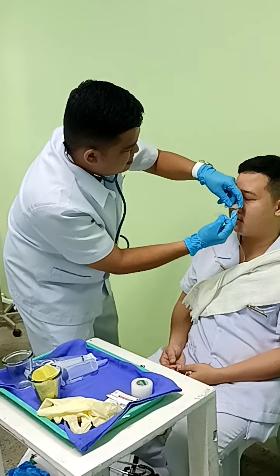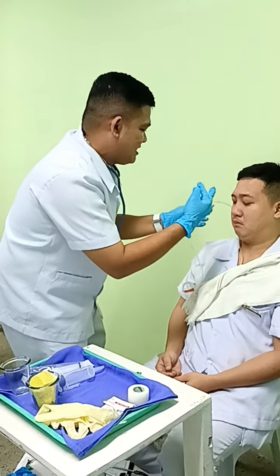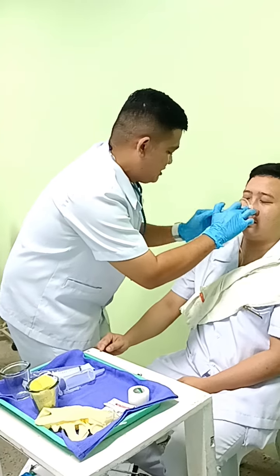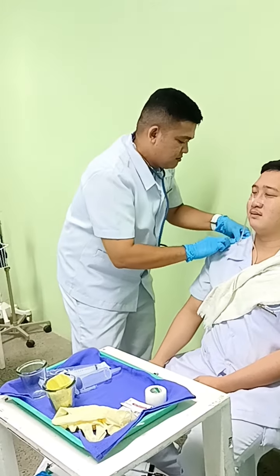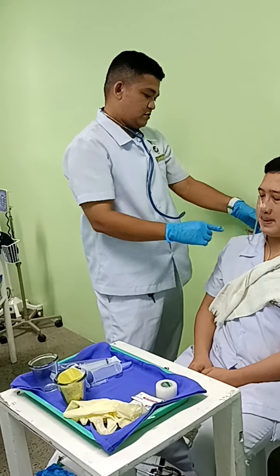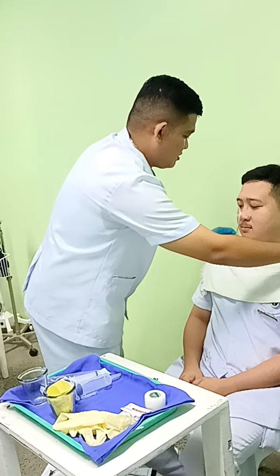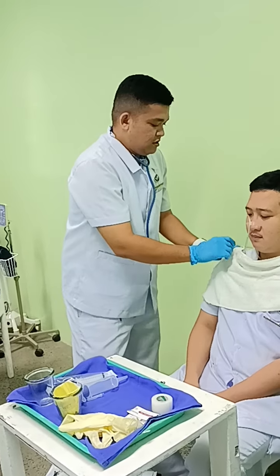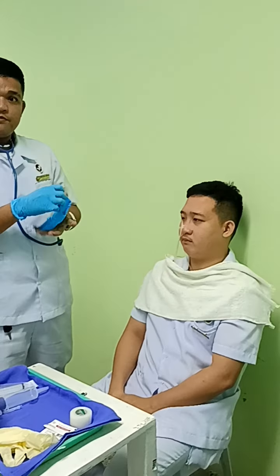To check for the tube placement. After checking for the tube placement, next is to check for the gastric residual volume.